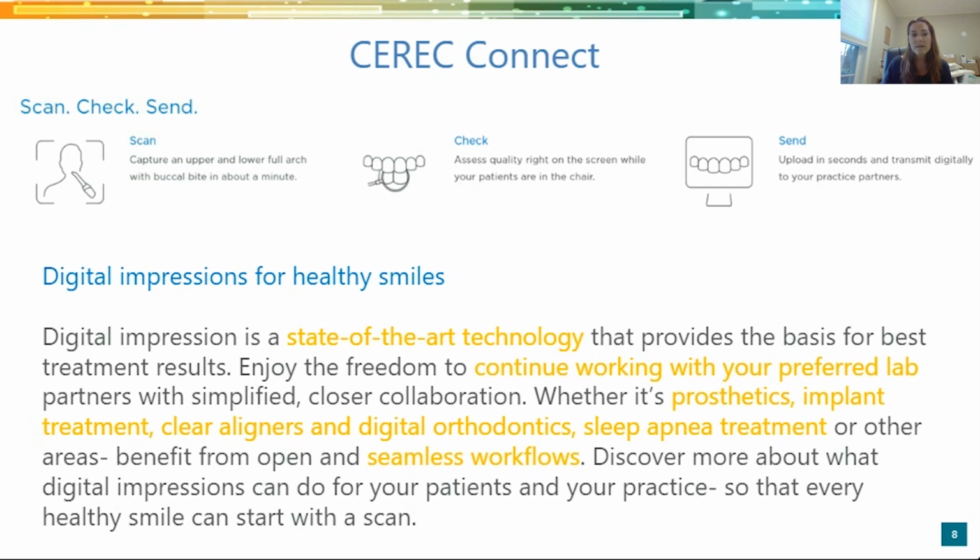So basically with that, you will still scan the upper and lower arches and your preps. Once you do that, just check to make sure you've got your margins, you've got good quality scans, and then you hit a button and send it to whatever lab that you want. If you've been working with a great lab, you can continue to work with them.